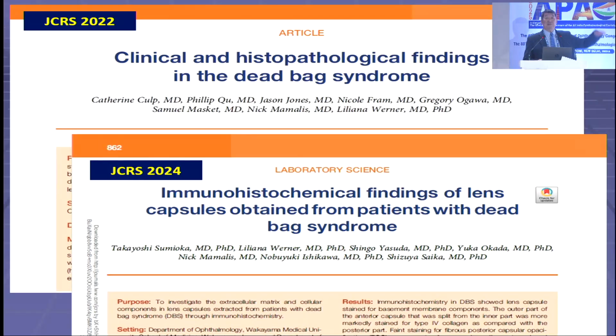So anyway, how many people in the audience have seen dead bag syndrome? So many, all of us, I think. Before you saw this video? Yeah.